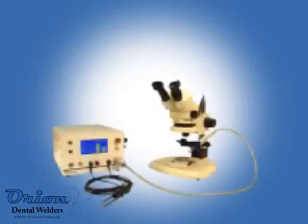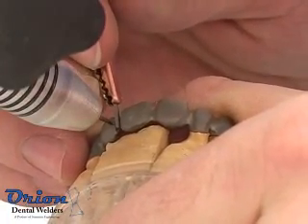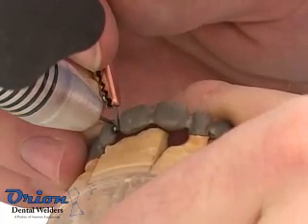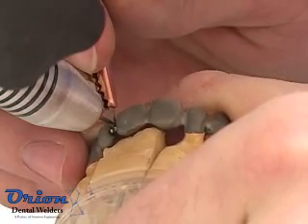Changing weld modes is accomplished at the touch of a button. A Pulsark Welder provides a single pulse of electrical energy to create a high temperature plasma. The process is similar to TIG welding but performs like a laser in welding characteristics and ease of use.